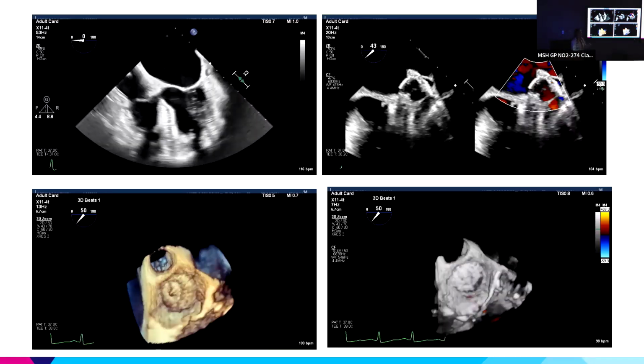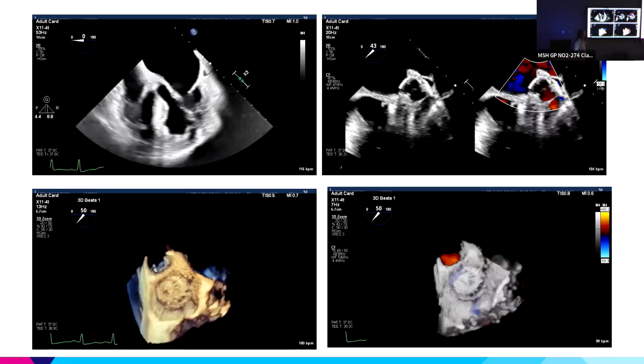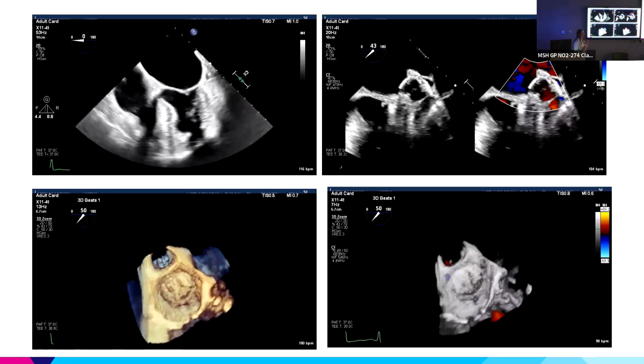That's fine. The lights are really tough here. You want to see the echo? It's like two states. Echoes stand out now.